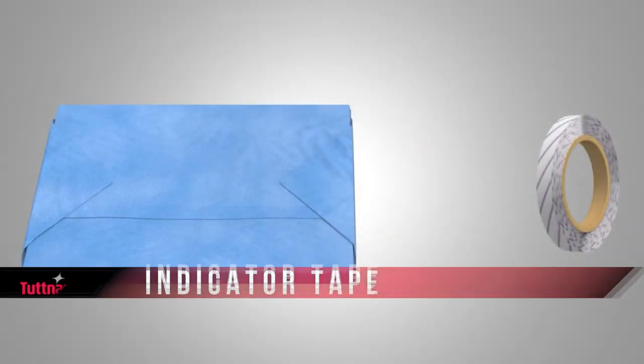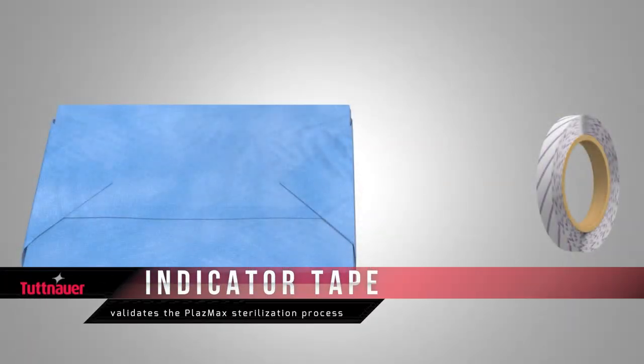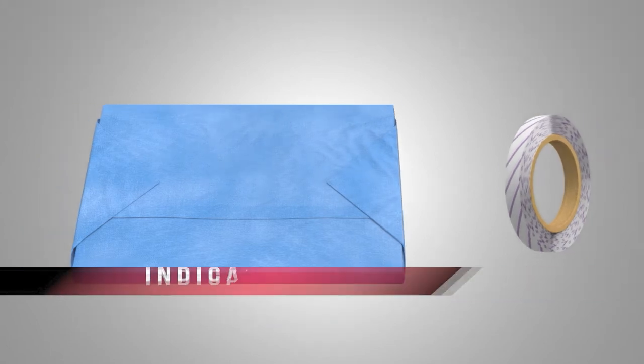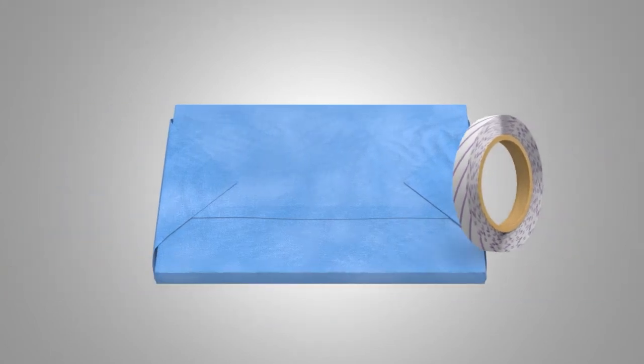Tutanaurs self-adhesive indicator tape is placed on the sterilization packages to identify items that have been exposed to the sterilization process.